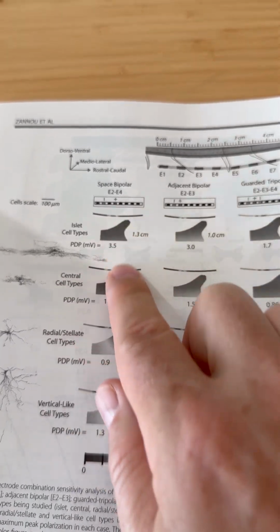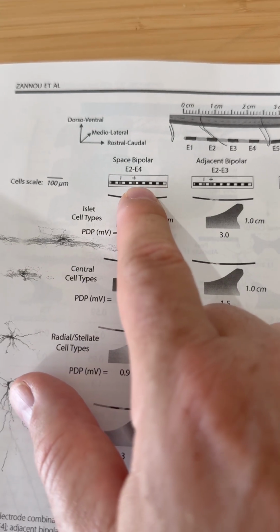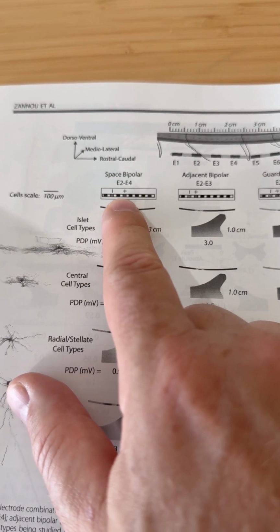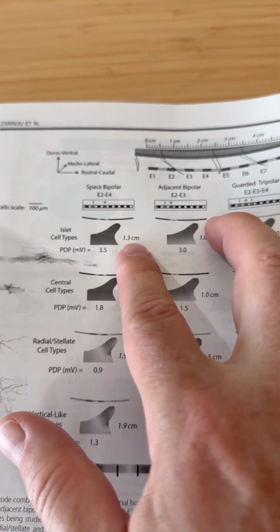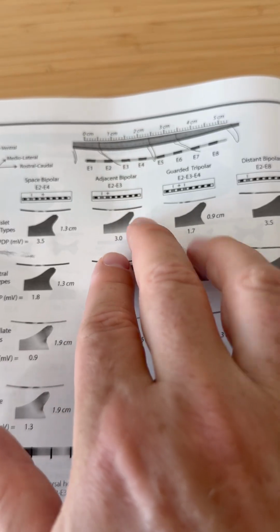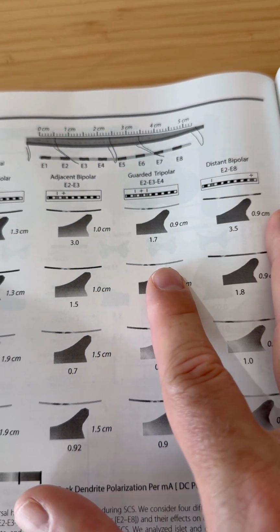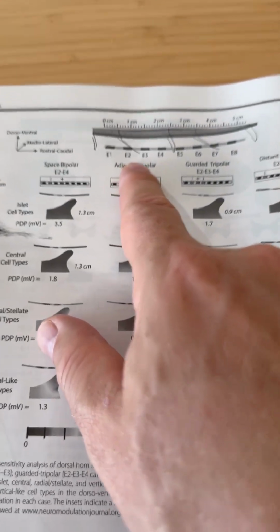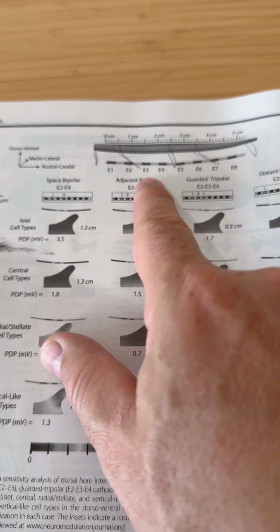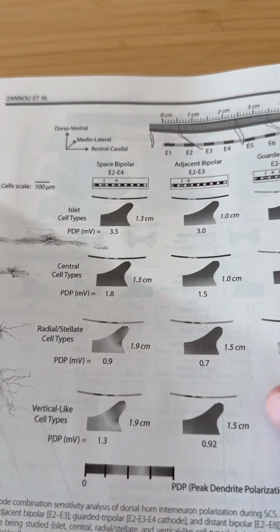We also did some additional analysis thinking about the role of montage. So the analysis I showed you before were for two adjacent electrodes that had one gap between them, but you can move the electrodes from having one electrode gap between them to being perfectly adjacent. You can think about a tripolar montage, or you could think of a distant bipolar montage. And the question we're basically asking here is, what is the impact of the montage that you use on how much potential interneuron polarization you get?